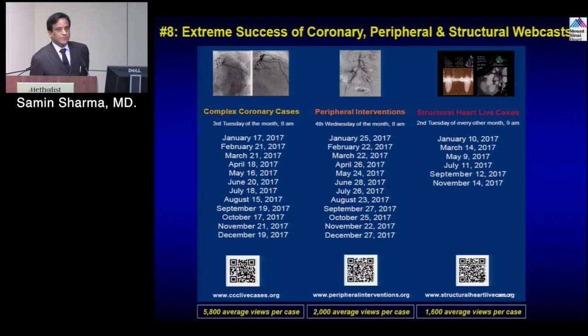Yeah. So actually, I'm aware of some literature that orbital atherectomy has gone away because it somehow created more slow flow, I was told. So we rarely use orbital atherectomy for peripheral interventions at our lab. Dr. Prakash Krishnan is the endovascular director. They do a lot of Silverhawk atherectomy, but as far as orbital atherectomy goes, very little. We do about 80, 85 peripheral interventions a month, and orbital atherectomy maybe 1 or 2 cases. The reason I was told is that somehow they have more debris with orbital atherectomy, and that's why it is not used there. So I'm a little surprised by that, because in coronary, there is no question that we have seen lower slow flow, although with rotational atherectomy it's quite low anyway, but definitely with orbital, one advantage is that it creates less slow flow.